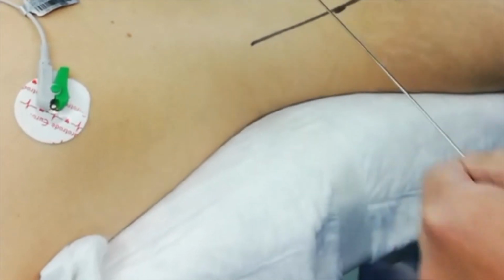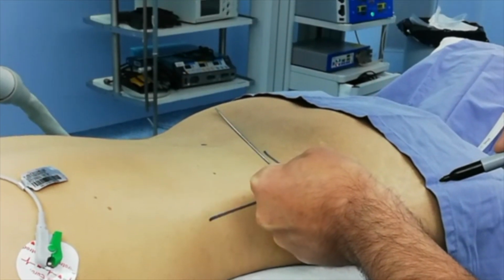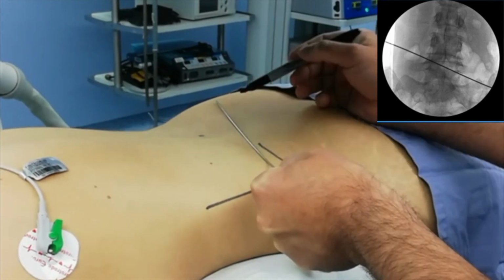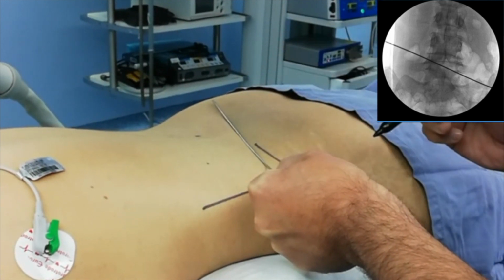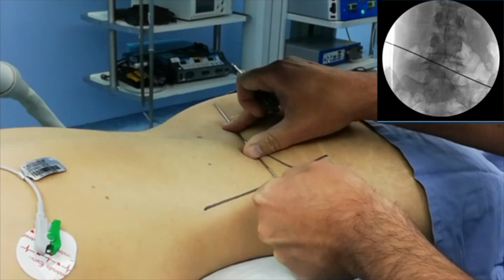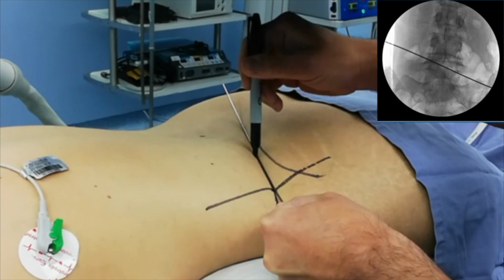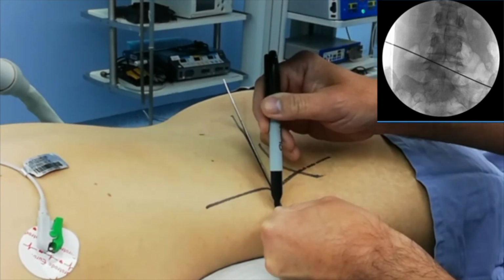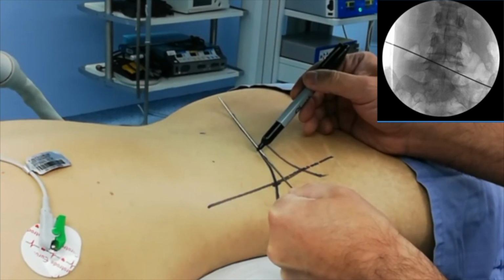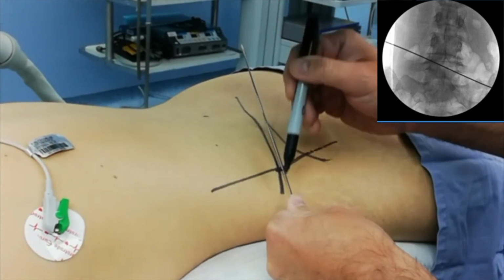The second line, as we can see on the X-ray, will be the AP line. X-ray, please. So the AP line will go from the superior border of the ipsilateral pedicle to the inferior border of the contralateral pedicle, as we can see on the view here. So this is the true AP. So I mark on the AP as it crosses the parallel line. So this is my first line, the AP line, top end of the pedicle on my side, lower end of the pedicle on the contralateral side. And I draw and extend the line towards the parallel line.